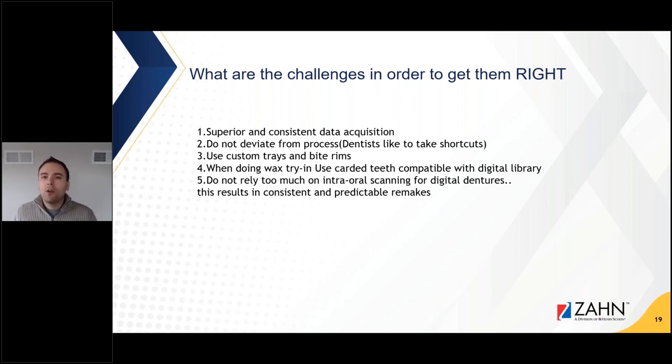Another good piece of advice is that sometimes denture labs would use a certain set of teeth, send it for try-in, but then they want to convert it into a digital denture. That particular set might not be compatible with what's available in a digital library for the denture. So if you're going to do a wax setup, it's always good to take those carded teeth that have their match in a library for digital dentures, so that what you design virtually will match with what you had sent out on a physical wax-up model.